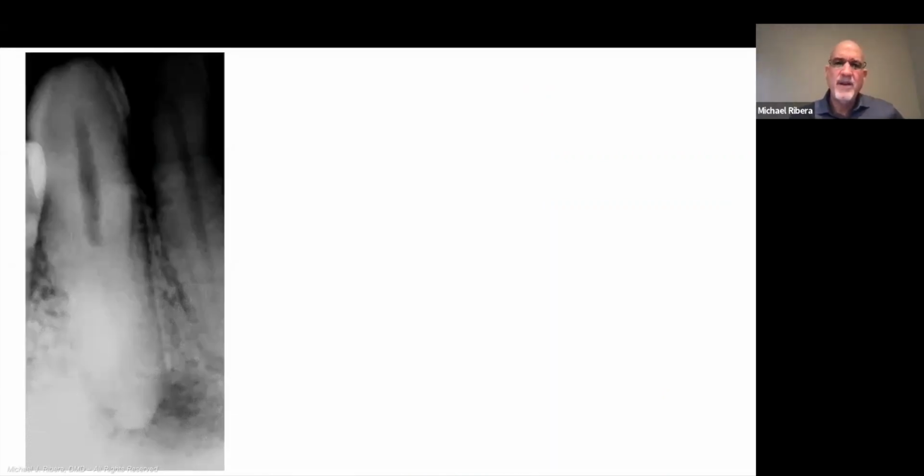This is how we proceeded. I was thinking, I'm definitely sending this patient to the hospital while he's here. Let me at least just get this root canal finished, or at least get the access sealed. That way he doesn't have to come back. I'm thinking hospital. That's the access. That's the sealer inside that deep chamber, a bit of gutta percha.